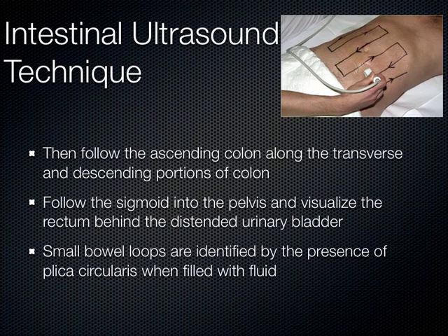When I'm doing a focused appendicitis exam, which I do quite often in the ER, I keep this mowing the lawn technique just around the right lower quadrant where the appendix is located, what we call McBurney's point. Or sometimes I just hand the transducer to the patient and say, put this where the pain is. They push it on their abdominal wall and help localize where I should start my search for the etiology of their pain.